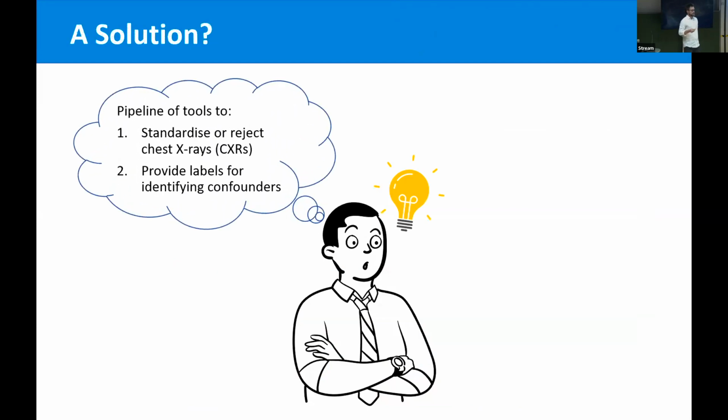We had a huge number of chest X-rays, and it was very hard to get someone to go through them all and label them to allow us to stratify and so on to try and remove these biases. So we thought we'd develop an automated tool that would try to label these biases so that we could stratify or use another technique to penalize the model for using them, or correct the image where possible. So can we remove the annotations and not create something that the model still uses to cheat?